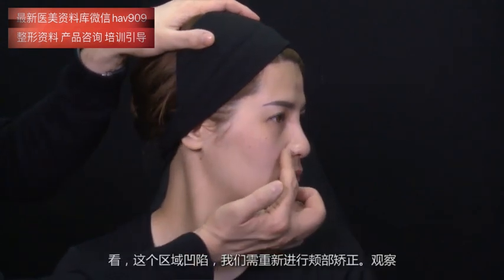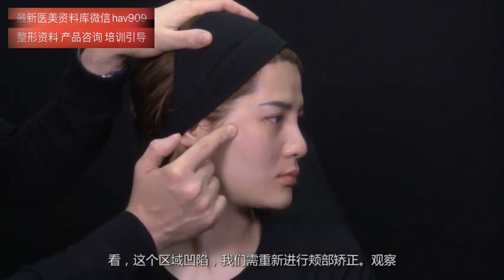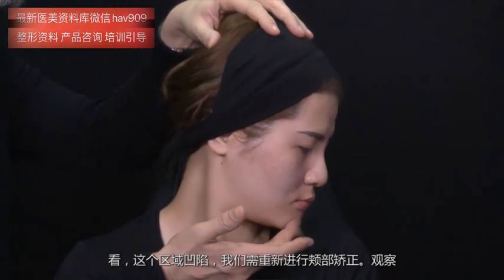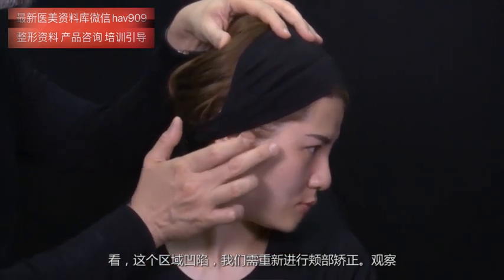Take a look, the area that is empty, and we need to go back to the correction of the cheeks. Observe.